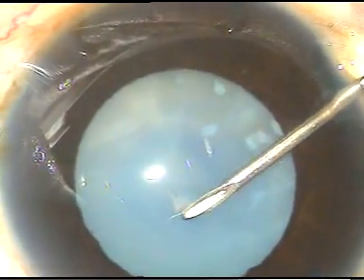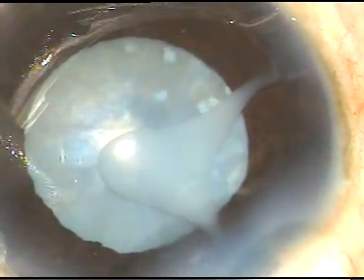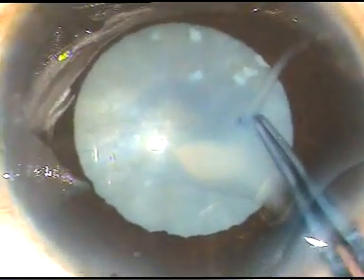Now, I am going to do capsulorhexis as I puncture the anterior pole. As the anterior capsule is punctured, milky fluid comes out, indicating this is a hypermature Morgagnian cataract.